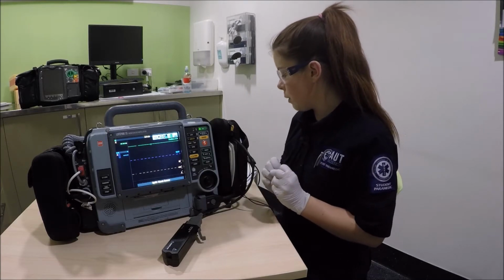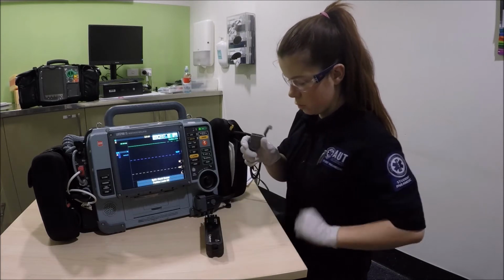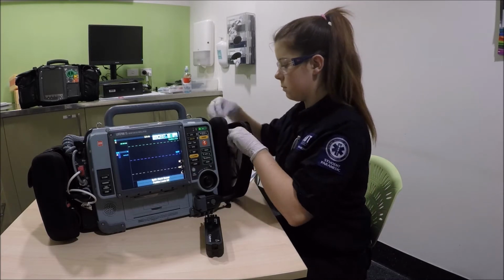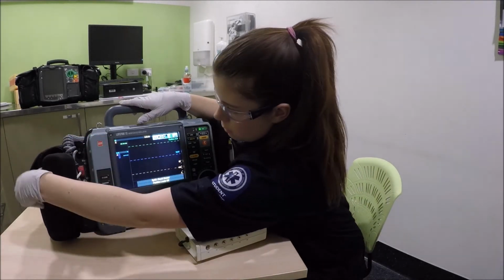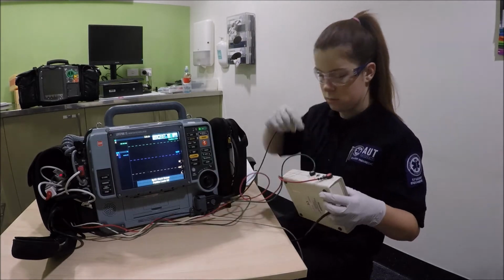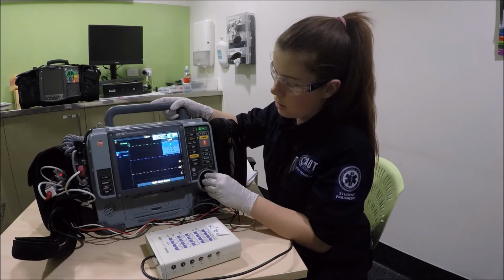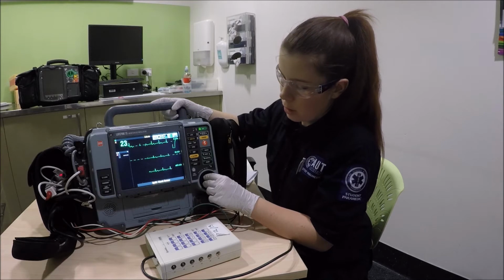So the next thing we're going to do is attach the leads to the simulator, making sure that we connect this back to the pads before we put it away. And as we change between leads, we'll now be able to see the rhythm coming up on the screen.